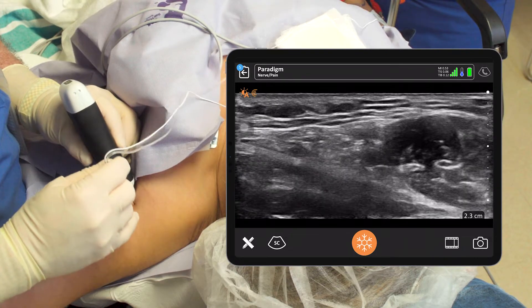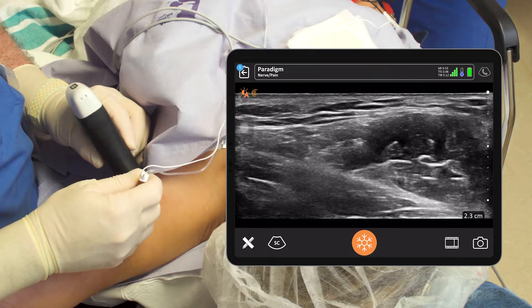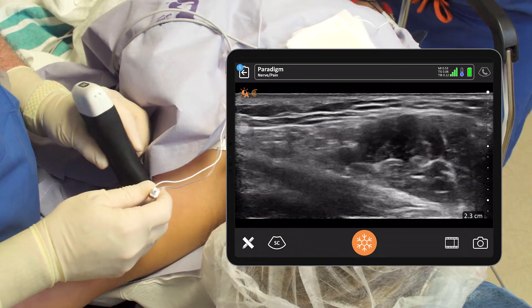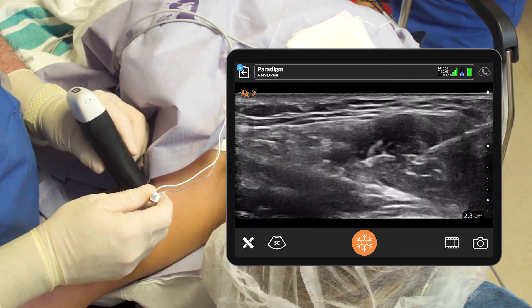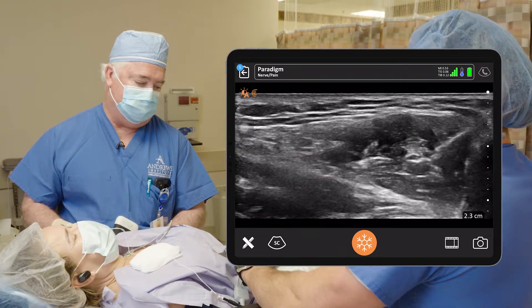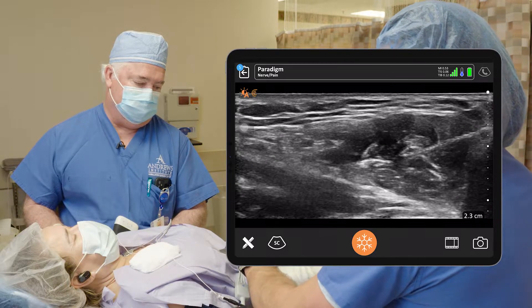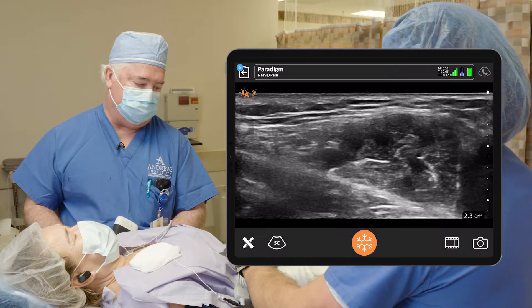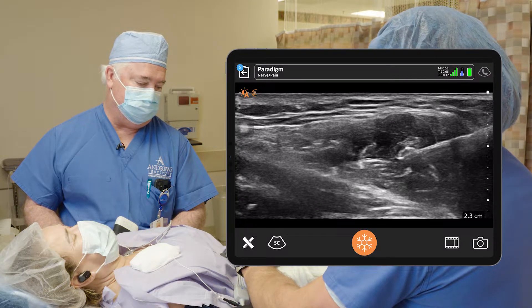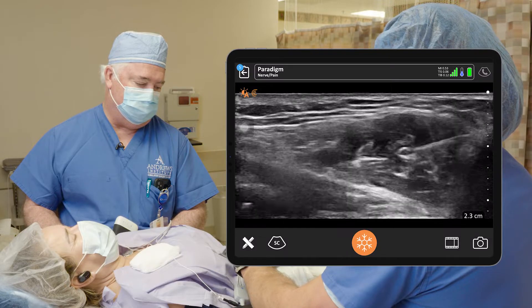We're going to come in here. First thing — I think this is the musculocutaneous right here. Yes, that's the musculocutaneous nerve. You saw that twitch, so we're going to put some local right there. We'll go under it here. You see how easy — I got a twitch before and then I'm right up next to it. We're not going to twitch anymore. It depends on where you are. Give me a couple more right there, and one more right there.